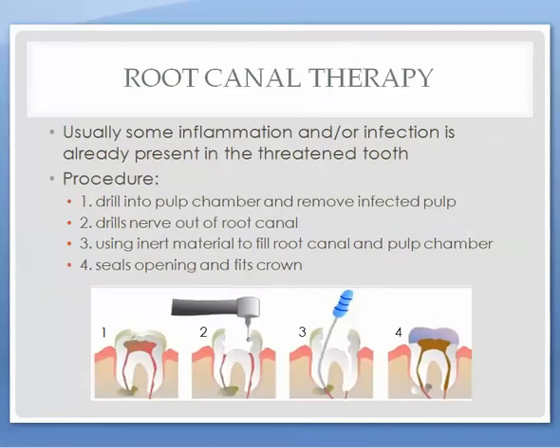As previously mentioned, root canal therapy is a pretty common procedure. By discussing the optical tools for RCT, it will serve as an overview of the ergonomic gaps and solutions for endodontists due to its high prevalence.